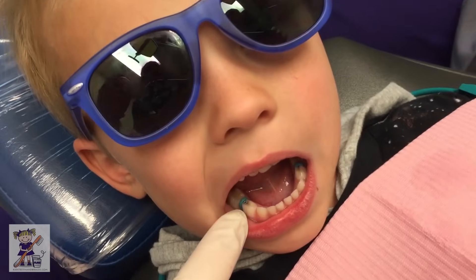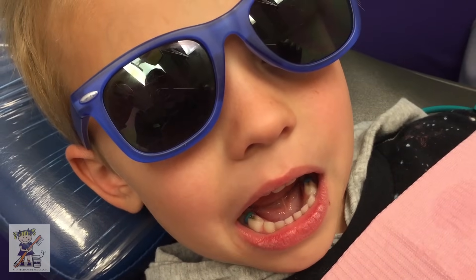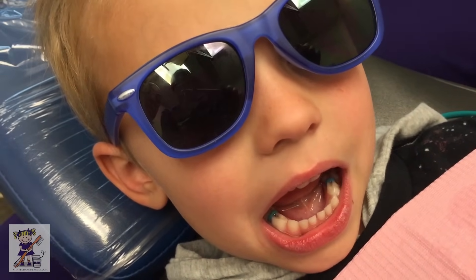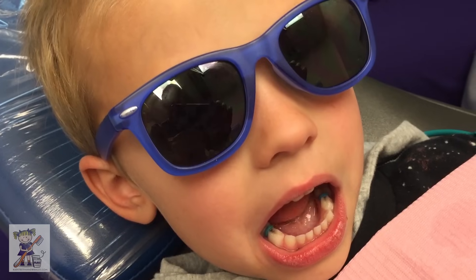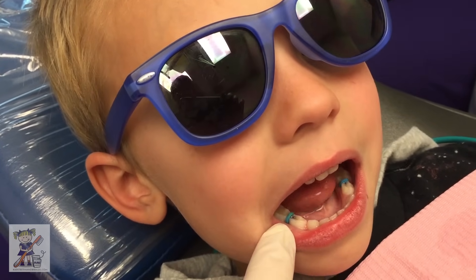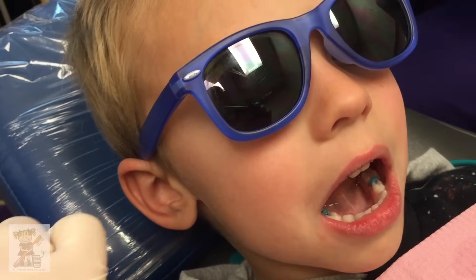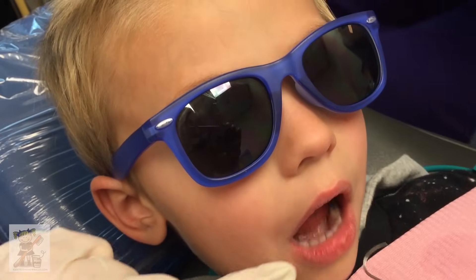We put some SDF on them to make them feel all better. And now we're going to put some superhero crowns. Do you want the Spider-Man crowns? We'll do the Spider-Man crowns to match your shoes. So you can see he's had the spacers in there for a week, and we're going to take those out.